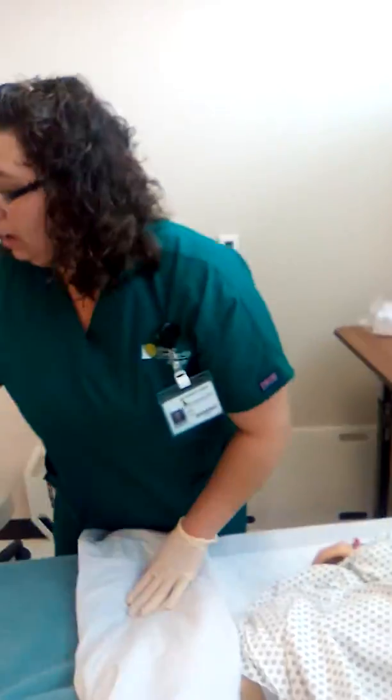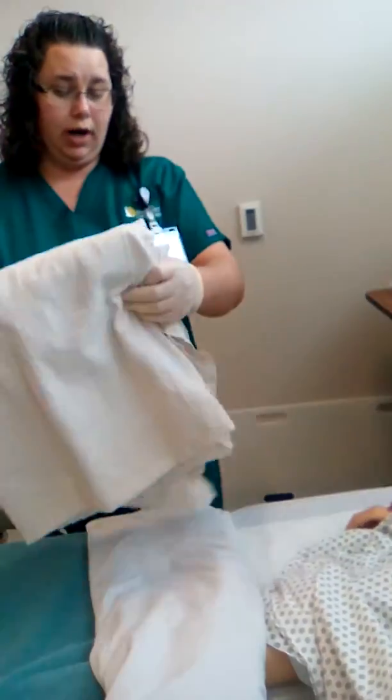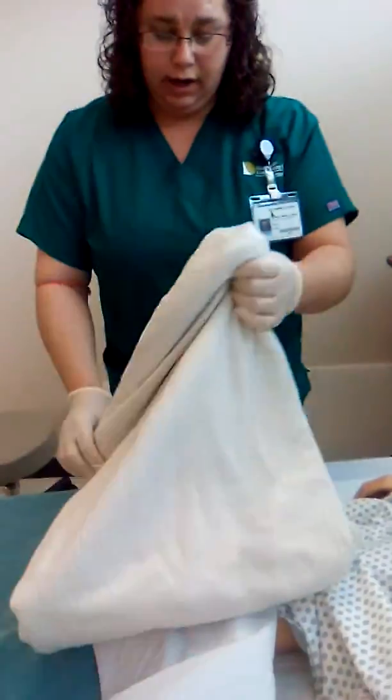And as I'm positioning and draping the patient, I will ensure that they have a soaker pad under them, or if not, I will place one.